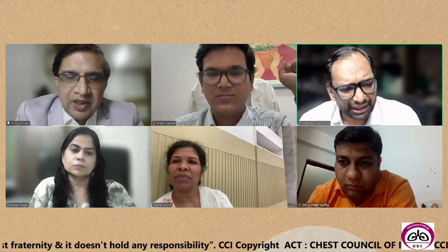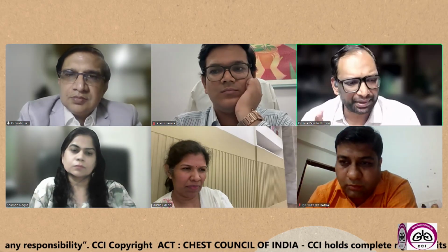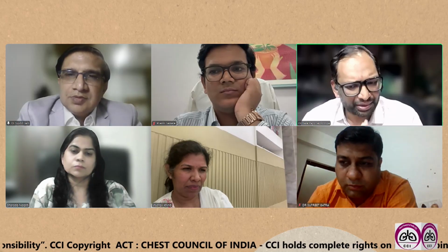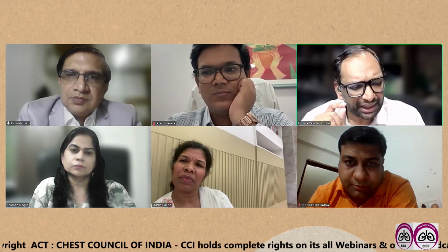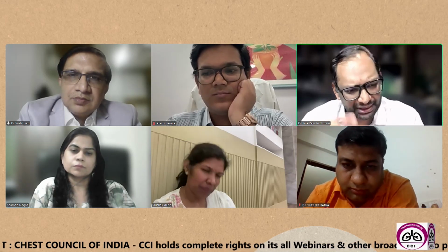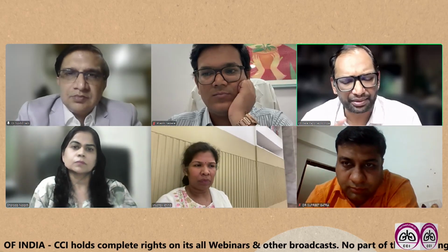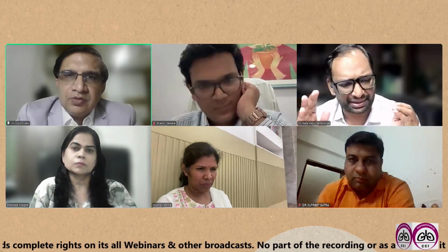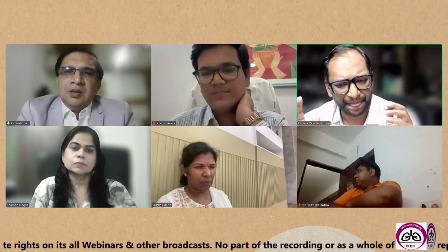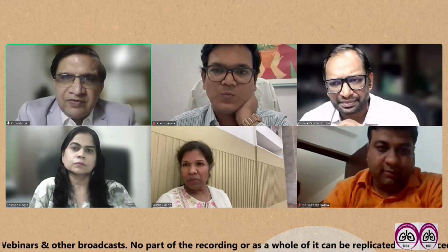Exactly. Even the guidelines and the publications say the same thing. It doesn't increase the diagnostic yield very much compared to a routine 22 or 21 gauge needle. Probably what they've seen is that the architectural deformity is much less with the ProCore and Franseen tip needles compared to the regular EBUS TBNA needles. But the cost increases dramatically. The cost is three times the cost of the regular EBUS needle.